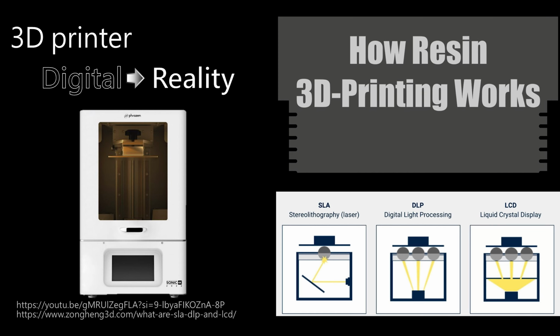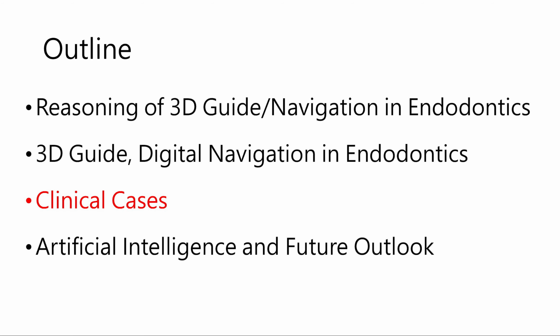And also, we have this 3D printer. You design your guide plate in 3D in the software, and you use the 3D printer to print this tooth out. Okay. So if you are not very clear on this concept, let's see the clinical cases. They will be clearer and you will get the point.